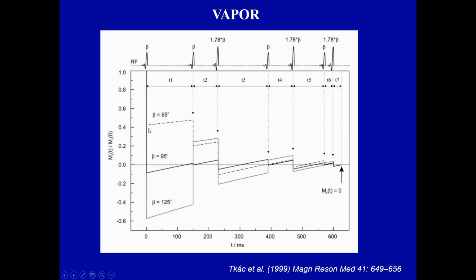But the idea is that if the ideal pulse is 95 degrees here, but some of the region sees 125 degrees or 65 degrees, and if you follow this recipe across here, apply these different pulses, they're all going to end up zeroing out your Z magnetization. And then at this point, you can run the PRESS or pulse acquire or whatever you're trying to run. So this is also a preparatory water suppression method. This happens before your main sequence.